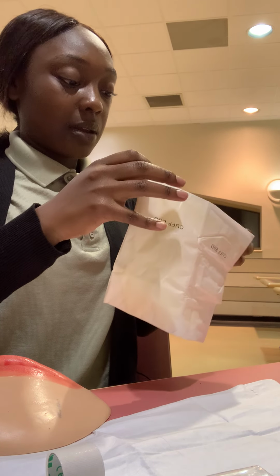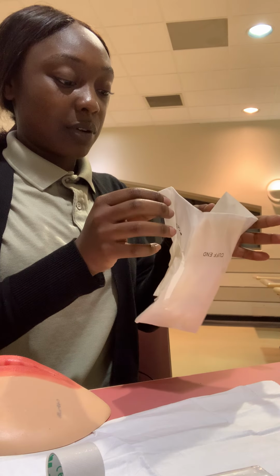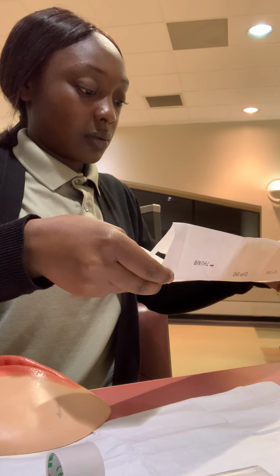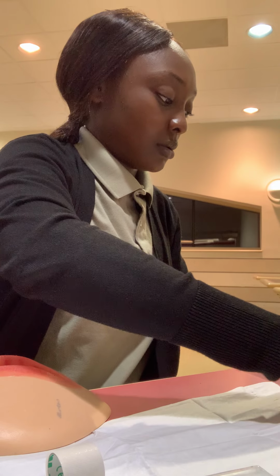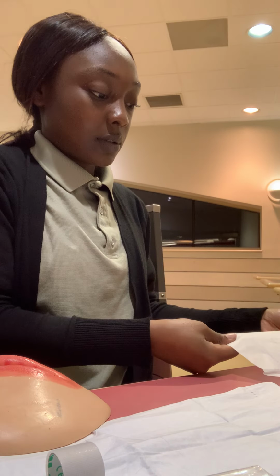And I'm only touching that 1 inch diameter. So my gloves are open, they're not touching my sterile field.